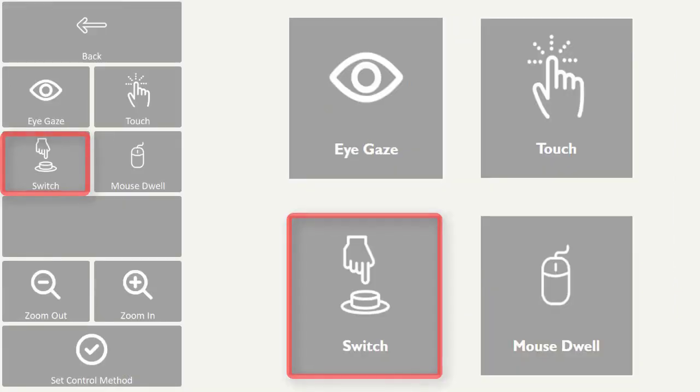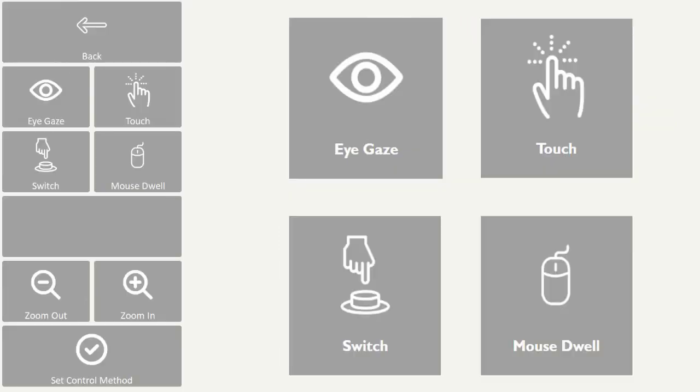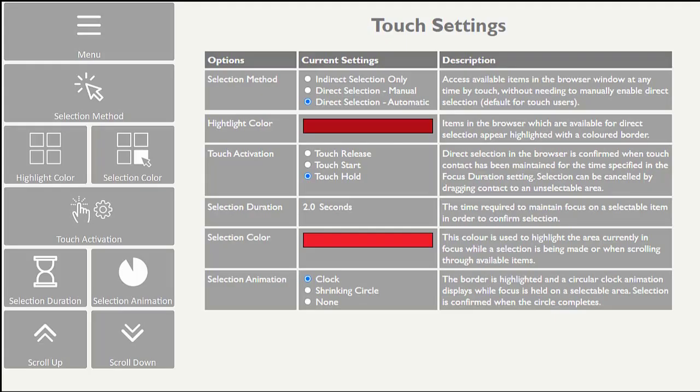and Touch, where you can choose whether you want the browser area to be selectable or not.